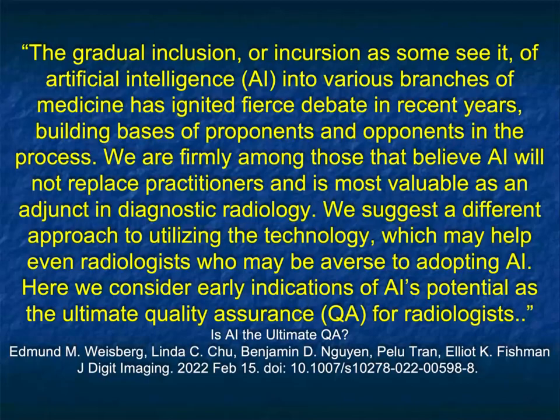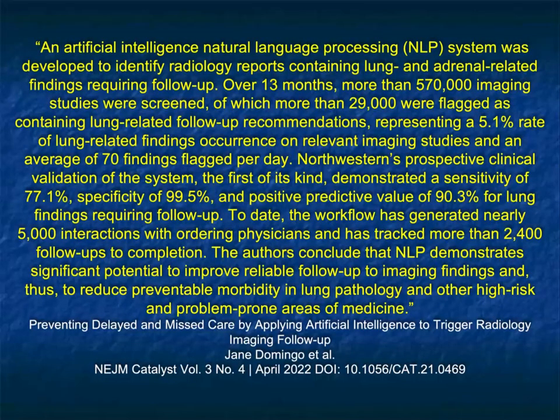So again, it may be an easy way of getting radiologists involved. And you can see a lot of work is being done looking at natural language processing. Here you can see large numbers of cases. The authors conclude that natural language processing demonstrates significant potential to improve reliable follow-up to imaging findings and thus to reduce preventable morbidity in lung pathology and other high-risk and problem-prone areas of medicine.